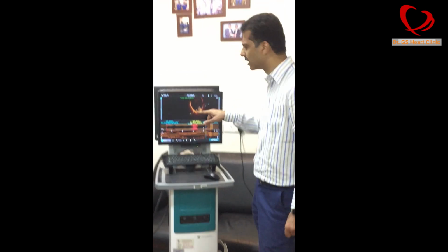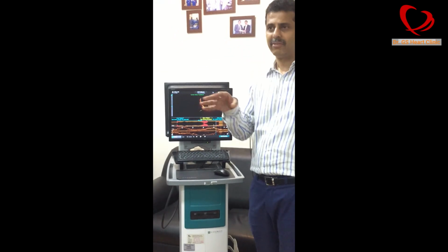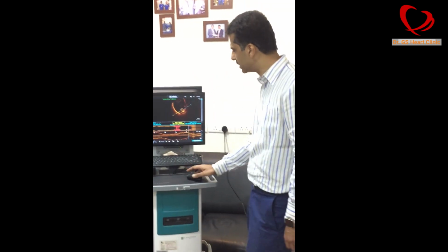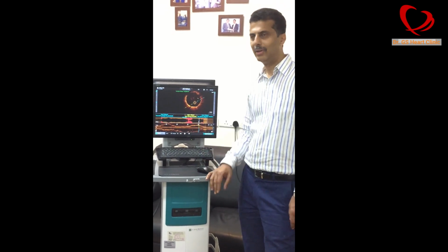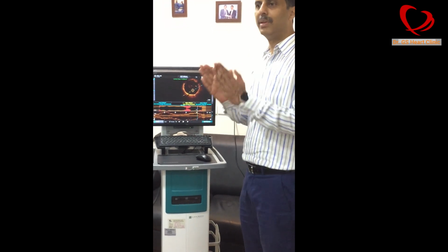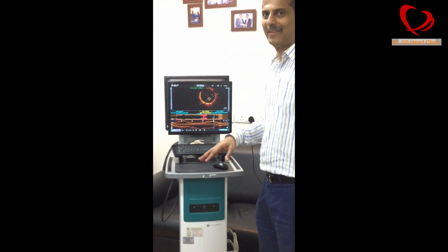These OCT images are normally highly magnified. If it is a small thing, we can even leave it. We have done that. But because this is a left main, we didn't want to take a chance. We put an 8mm stent there, and then we did a final postdilatation and got an excellent result. It means it's a clear path, and the area is also very nice, beautiful. And we used a big 4.5mm balloon, nicely plastered with a big balloon, and got a great result.